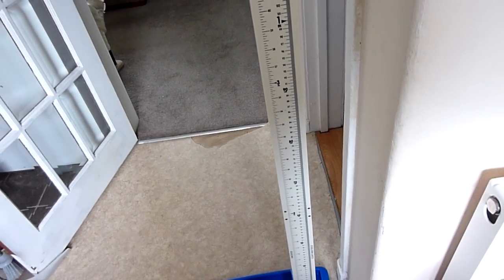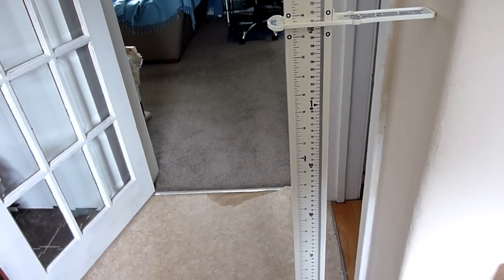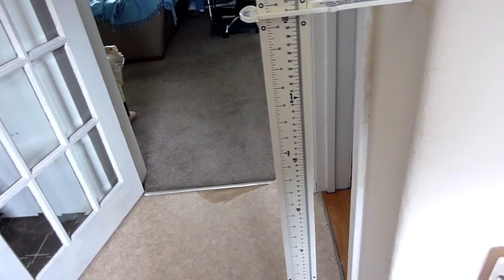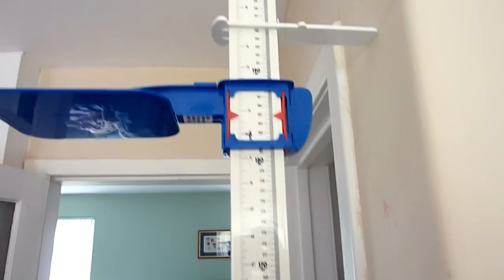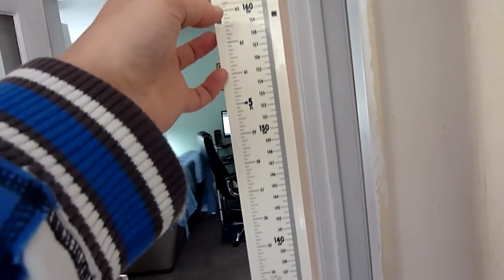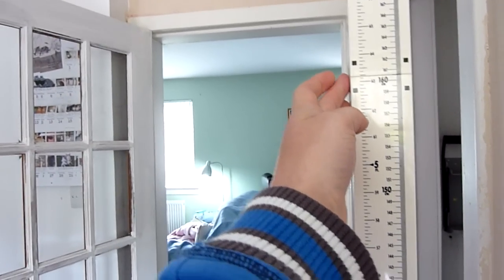Usually when I take measurements I face the stadiometer because it's easier to do a measurement like that, but this time I'm going to do one with my back against it and looking away from the stadiometer.